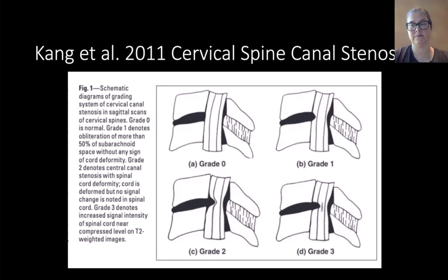Yeah, thank you. Can I also ask, this may be a silly question. So there's posterior epidural fat. Is there also anterior epidural fat, or is there nothing anterior, like no fat? Venous plexus anteriorly, but no, I don't think there's usually fat. I think it's posterior. Okay, thank you. Within the lumbar spine, yeah.